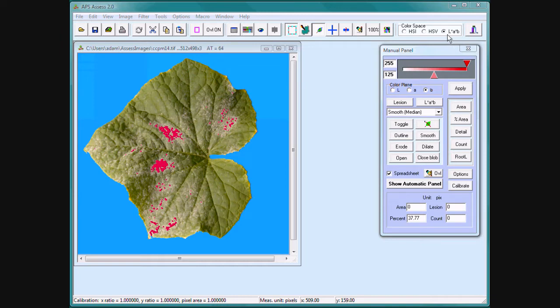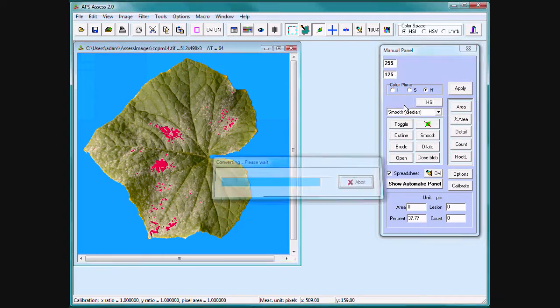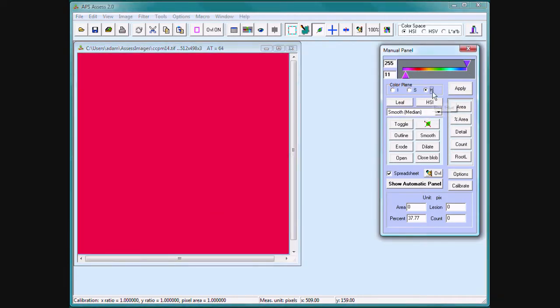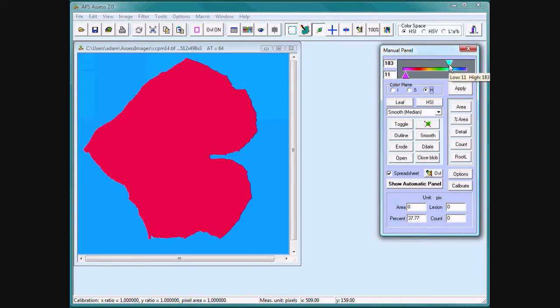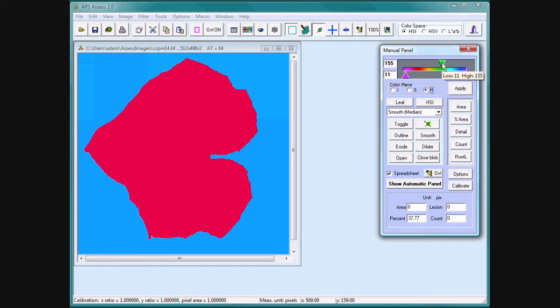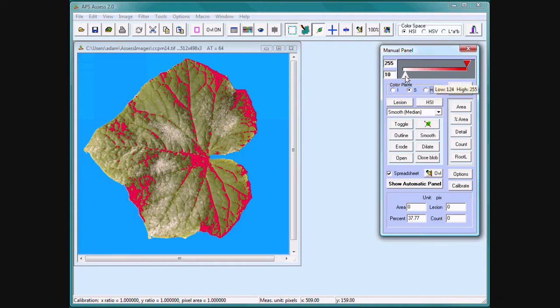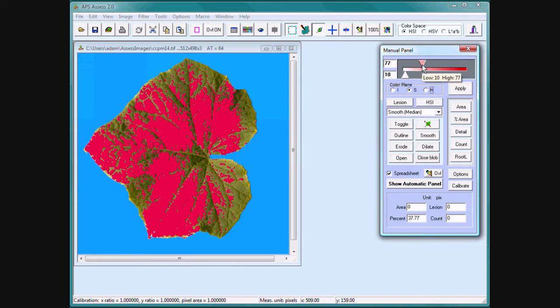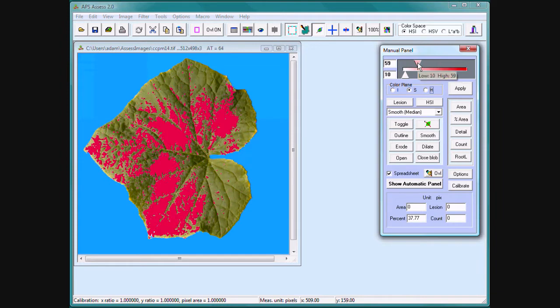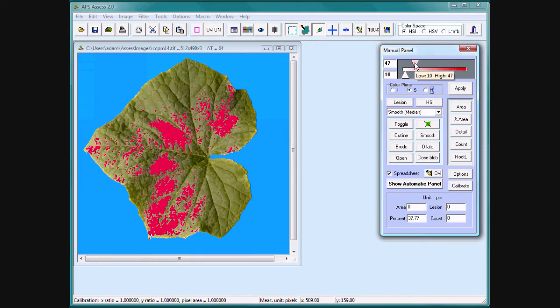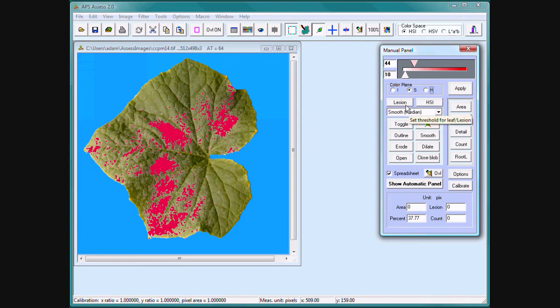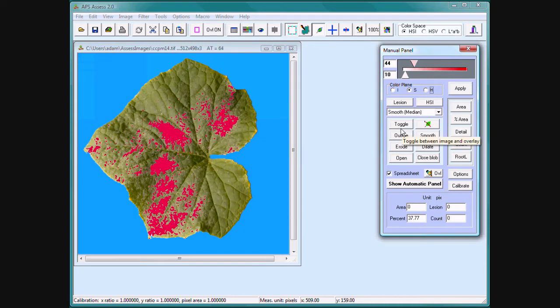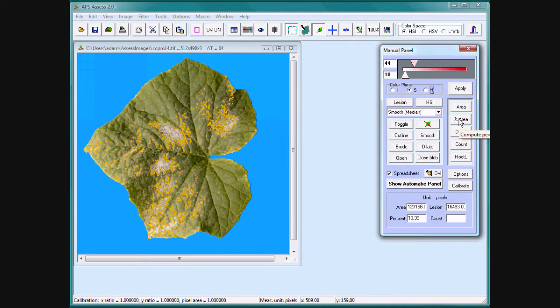Change from Lab to HSI color space. Threshold the leaf with the hue. Often when you have a blue background or a colored background, you use hue to threshold the leaf. Threshold the lesions in this case with saturation because the lesion is white. Click on Percent Area.